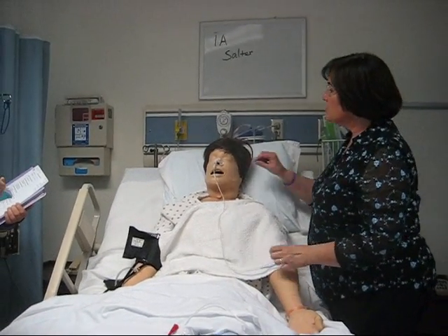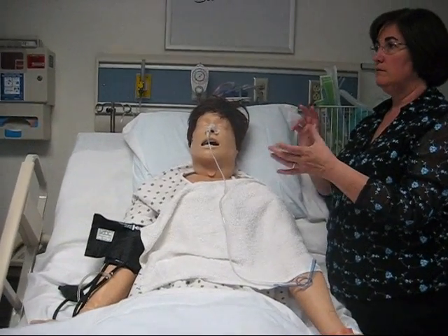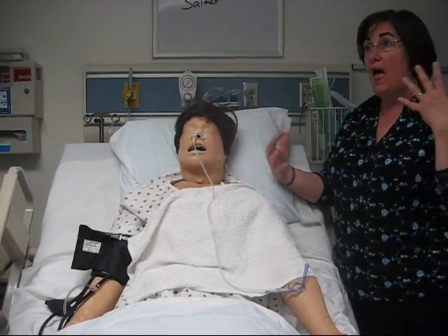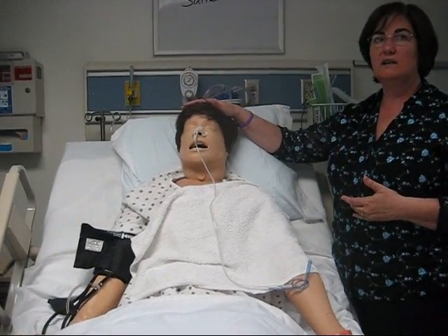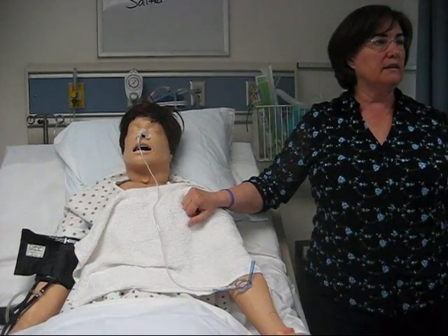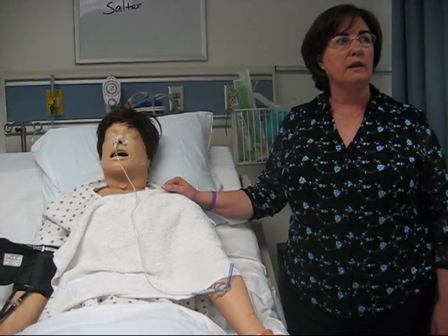When a person has a tube placed, they should be able to breathe and talk. It shouldn't be that they're gasping or turning blue or any of that kind of stuff. But people with very low levels of cognition or cranial nerve function, you can put a tube right in their lungs and they'll just look at you. And they may not particularly desaturate or cause a problem, and so on.